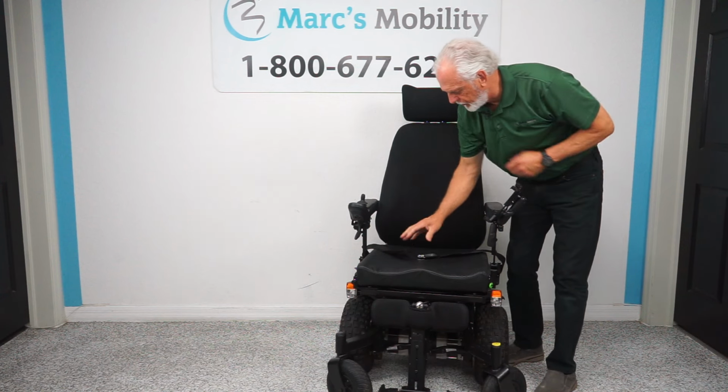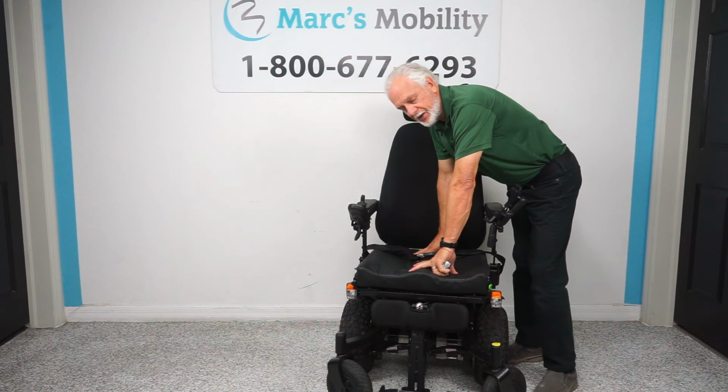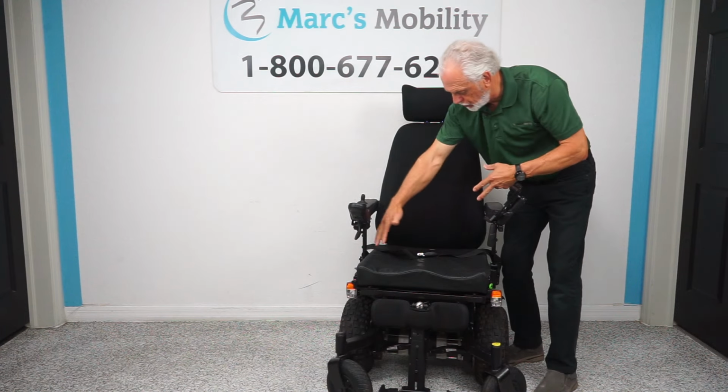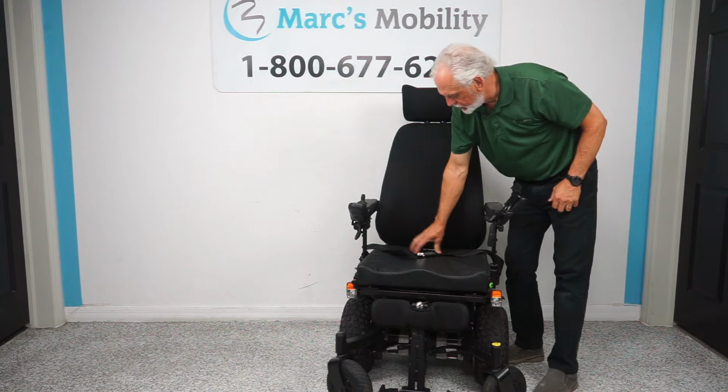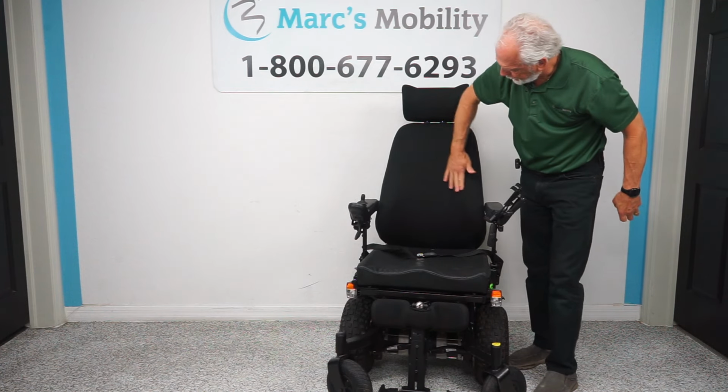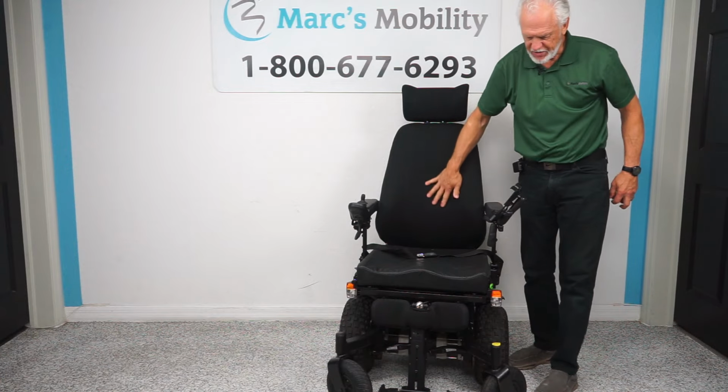You can put your own seat on here. These are just Velcro. So these seats right here, if you want to have air, foam, gel, memory foam, you can just buy your own cushion on here, okay? This one has gel in the back. It's all gel back here and foam here. This is a breathable material so you don't sweat in your chair.